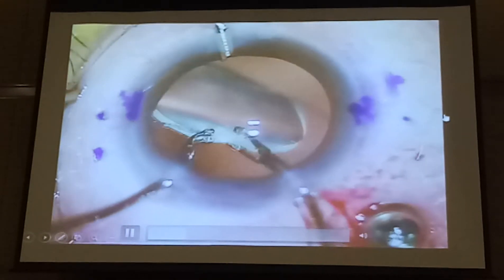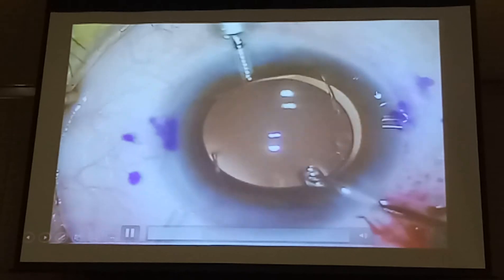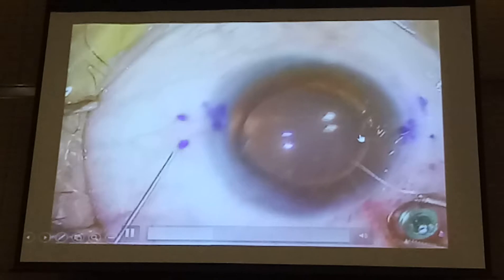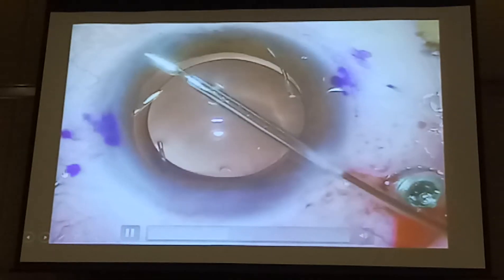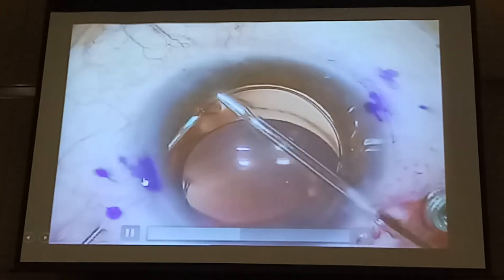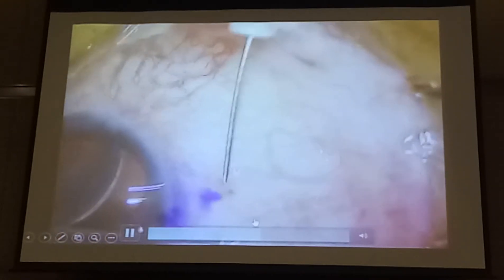I've removed all vitreous strands that could possibly be there, and brought it to the anterior chamber. You place this in a position actually opposite to a glue lens — you go, you slide past the conjunctiva, and you just go a little above this — it's like a 20-degree angle of approach. And you enter where you think your point of fixation should be. Using 30-gauge needles — these are very soft and spindly, hard to control sometimes.